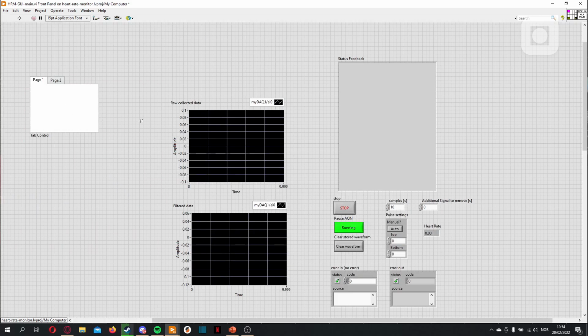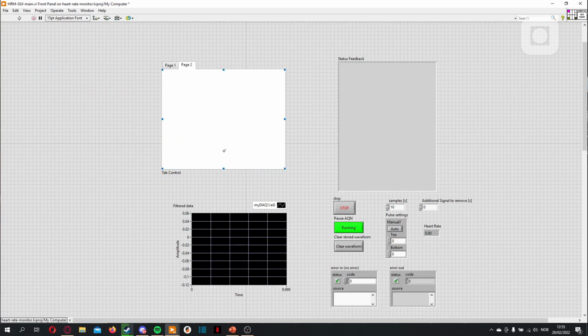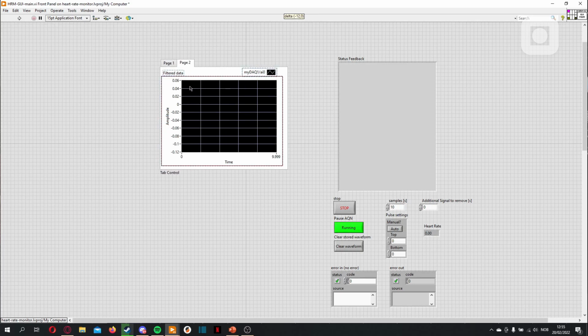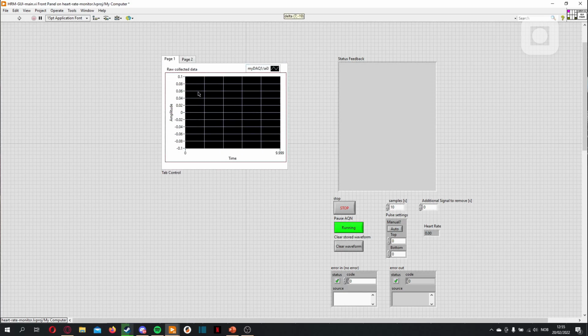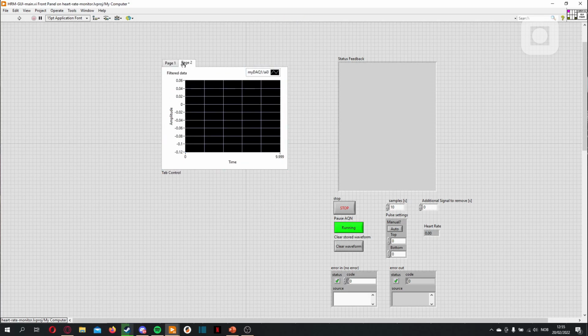We want to use a tab control because then we can get more in the same amount of space. Sometimes people use tabs for everything, and it can go a little bit overboard, but we'll try to be restrictive. We'll just start by placing both of these in here. I like to keep them in the same place. What I usually do is just push them one up and to the side where I see they're moving. So you see it gets bigger in that direction when I push it. That means that's enough. And you see me pushing this, which means it's perfectly centered. Now with this one, I'll do the same. And now you can see they're in the same place.